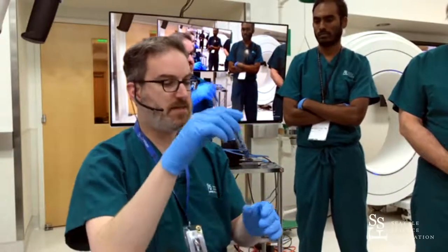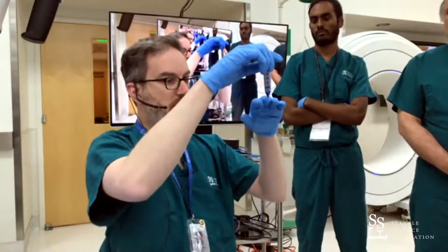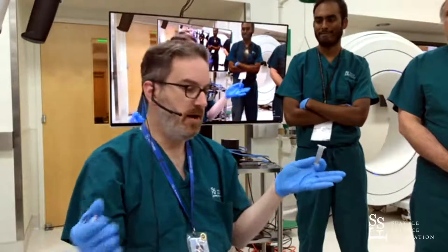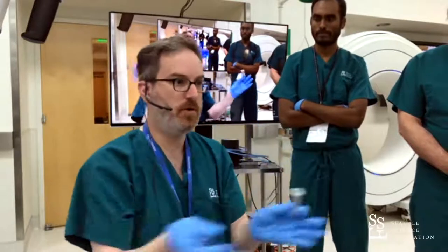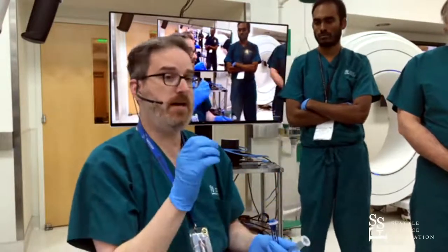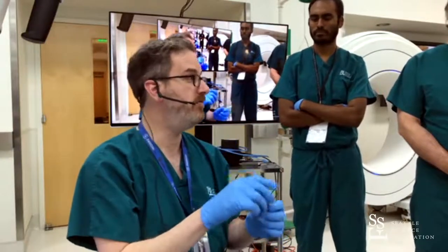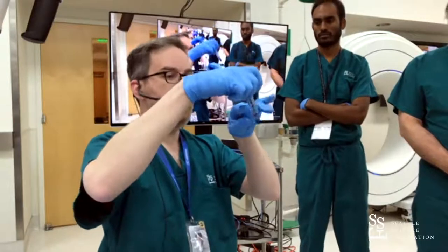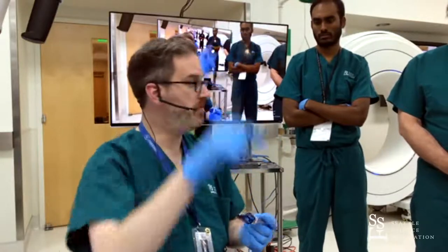The other more advanced technique, more useful for softer lesions, is to actually dock in the middle of the target. The advantage is that you've got all the intracranial pressure driving the lesion out, so as you core it out from the inside it's being delivered into your working space. The disadvantage is that you have no situational awareness, so you have to rely exclusively on three things: your navigation, and if your navigation is off for a small subcortical target you may end up off target looking at normal white matter. That's where ultrasound comes into play.